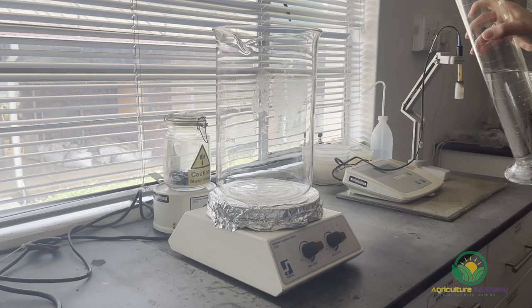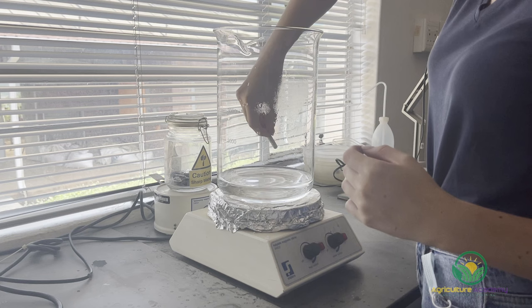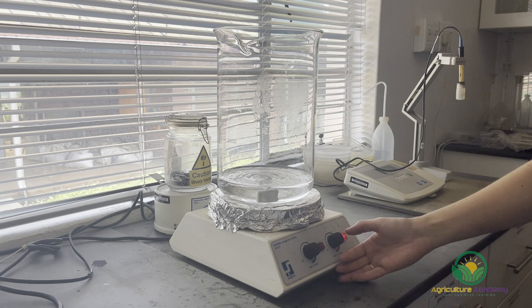Let's get started with how we made our growing medium. We followed the recipe to make up 1 liter of Knudsen's orchid media. A glass beaker was placed on a magnetic stirrer and 500 milliliters of distilled water was added. If you are doing this at home, you can mix this medium on the stove or warm in the microwave. Just make sure all your equipment is clean.